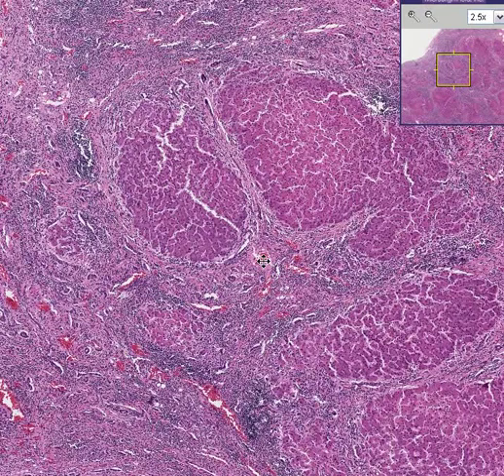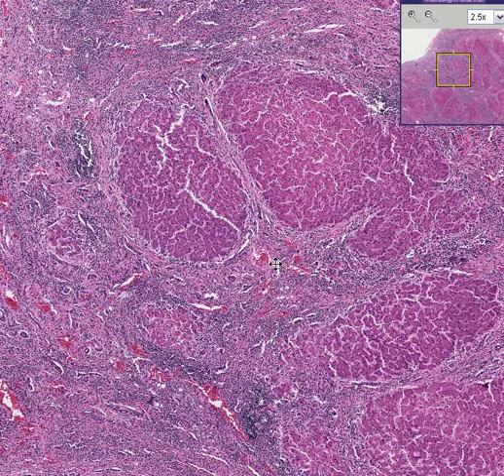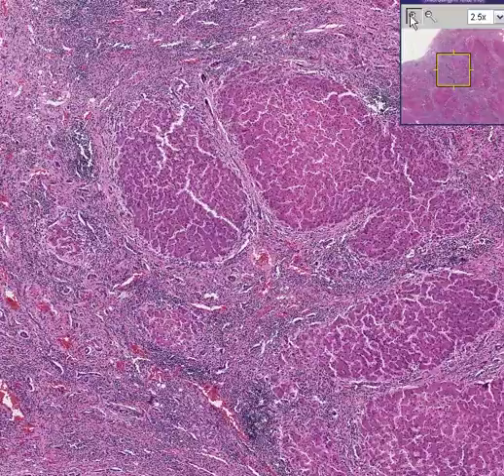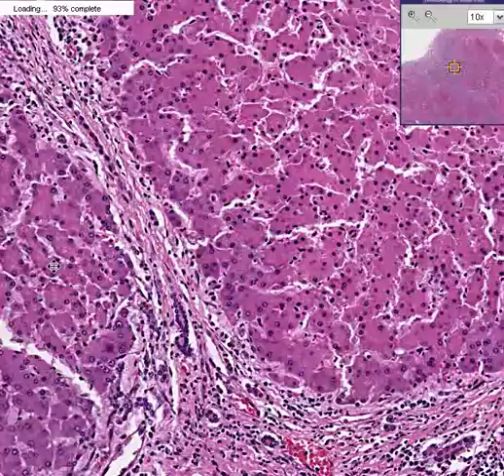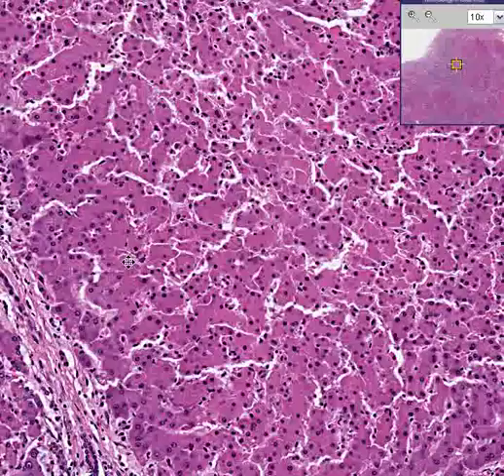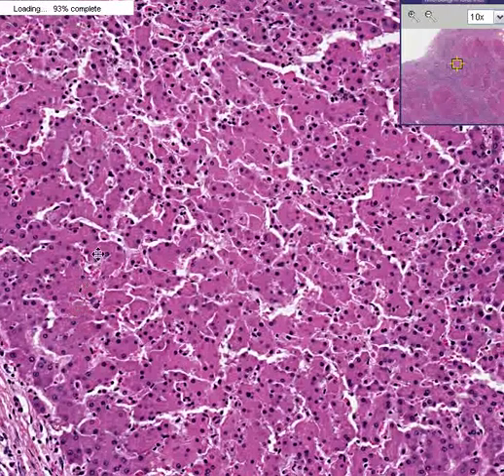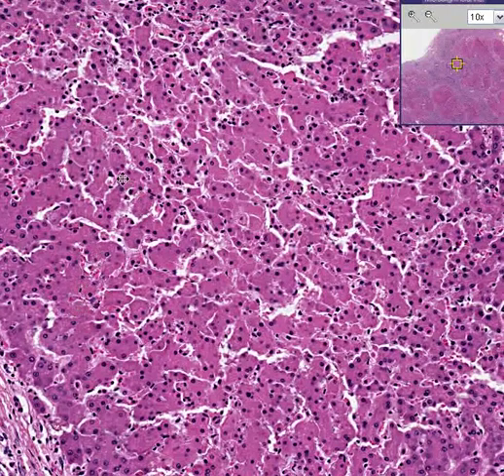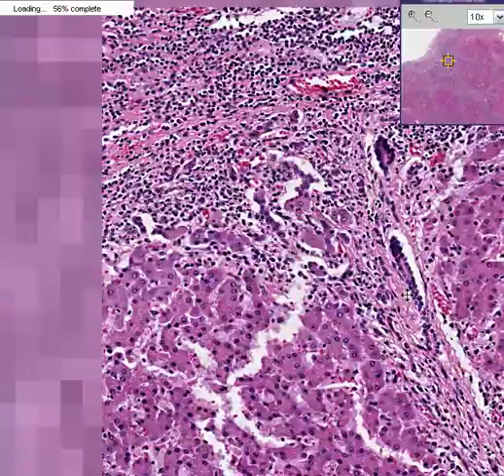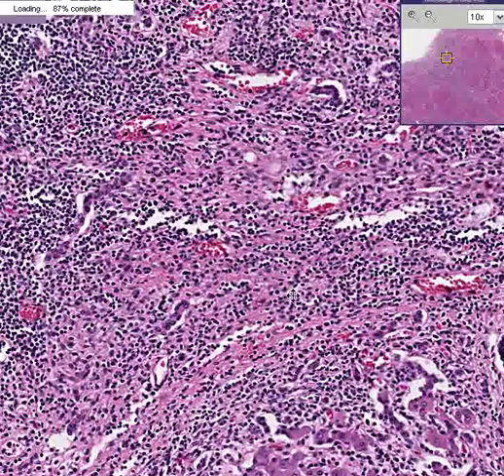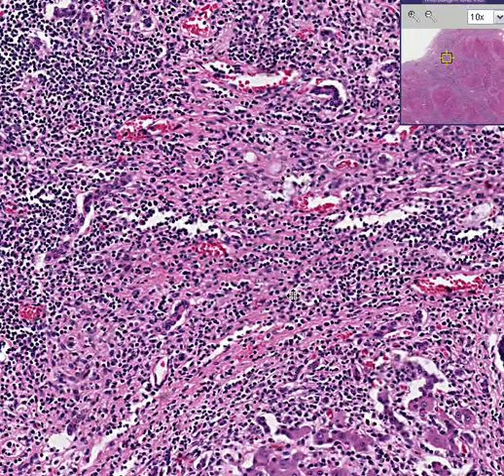Extending from former portal areas to other portal areas are these bands of irregular connective tissue. If this was the only part of the liver you looked at, you might say this looks pretty normal. But if you move out a little bit, you might say, where's the liver?